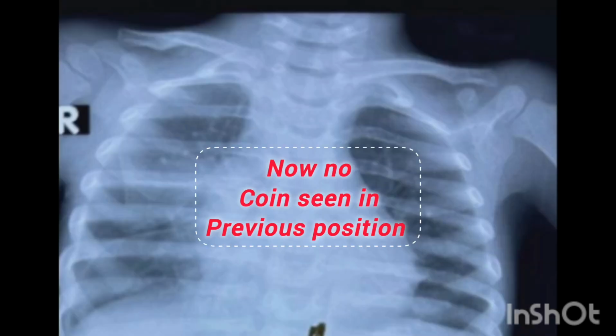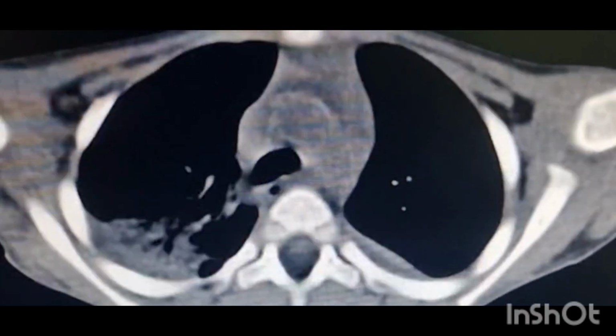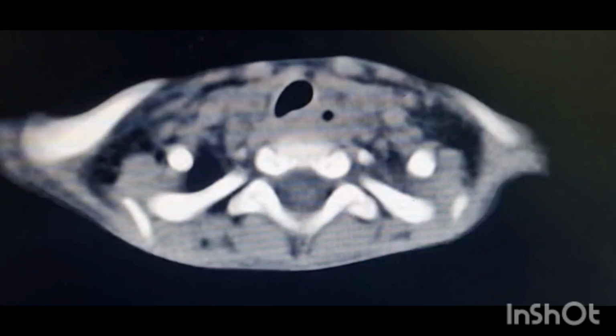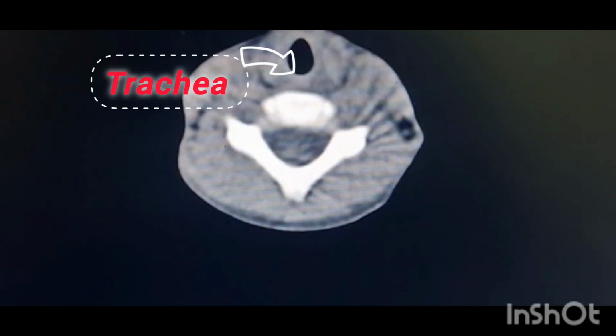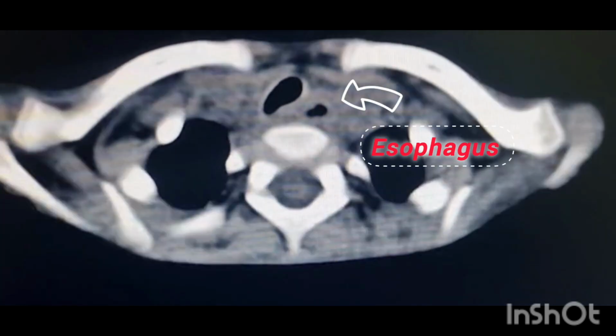This is the X-ray after the removal of the coin, where we don't see any foreign body. So this coin was removed under anesthesia by flexible endoscopy. After the procedure, a CT scan of the chest with neck was performed. In the CT scan, we see no foreign body, that is the coin, in the esophagus or trachea.